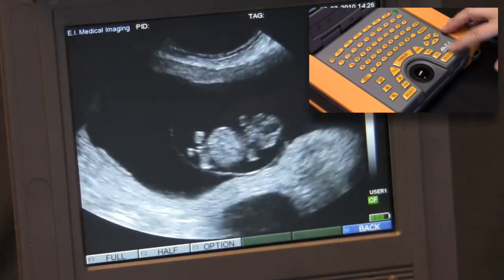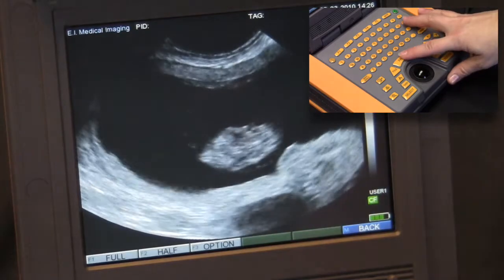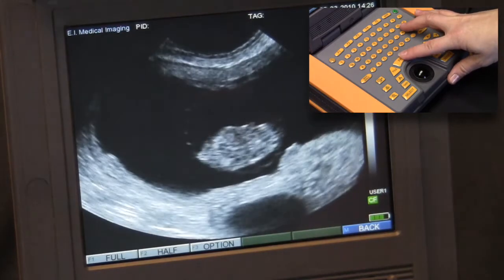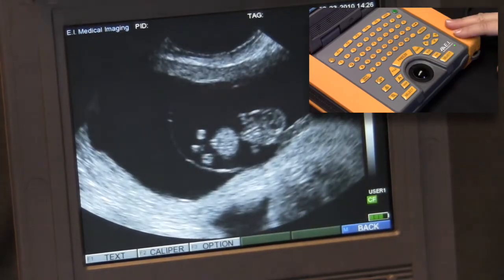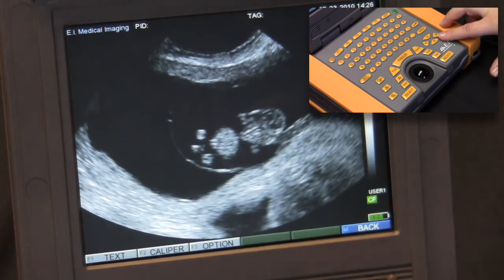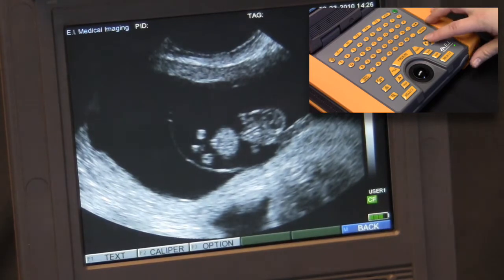I'll first press the freeze button to obtain my desired image. If I've missed the frame that I was aiming for, the arrow keys can be used to scroll back and find it.